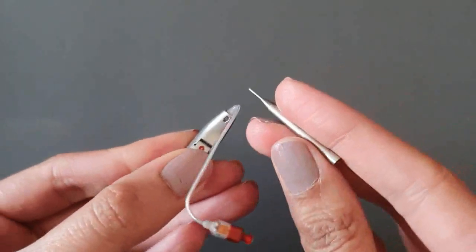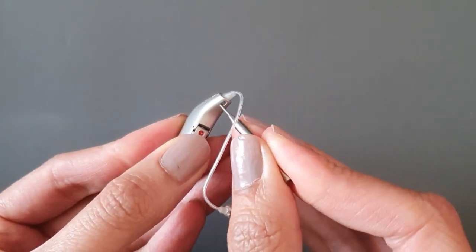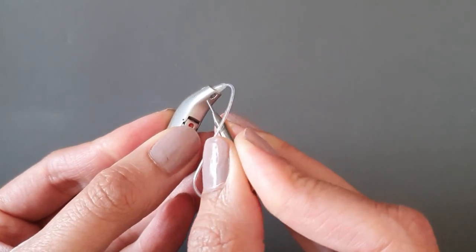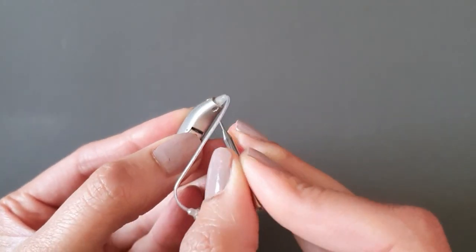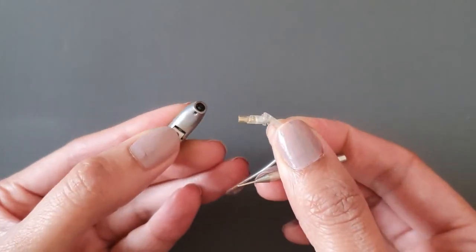To do this, get your pin and push it in a downward and upward direction until you hear it click and the speaker wire is pushed out. Then you can gently pull away the speaker wire.